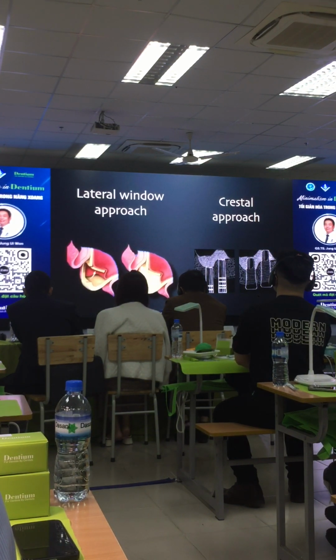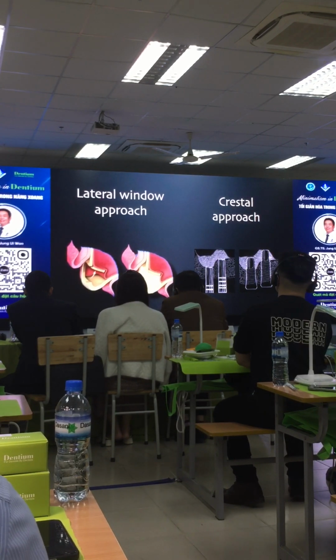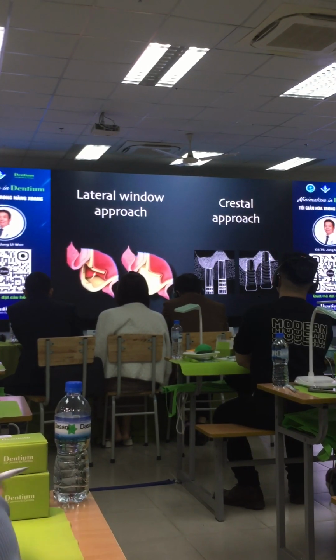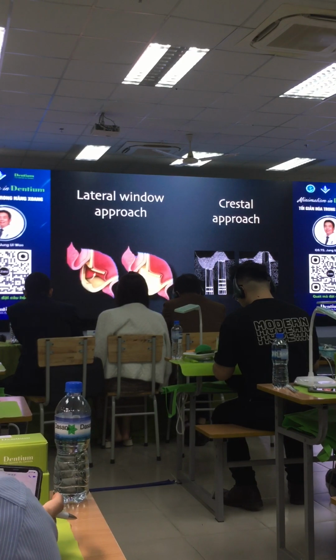As you know, sinus augmentation procedure can be classified into lateral and crestal approach. In general, which procedure to use is determined based on the remaining bone height available. As another determining factor, it is important how predictably and safely the sinus membrane can be elevated by using either the lateral window or the crestal approach.